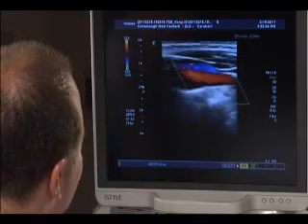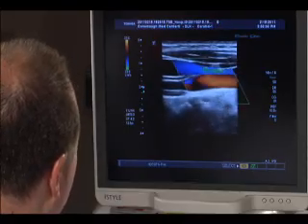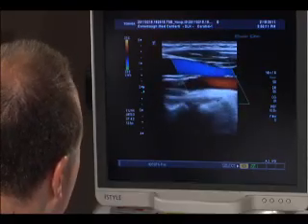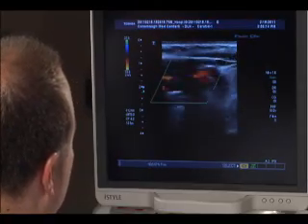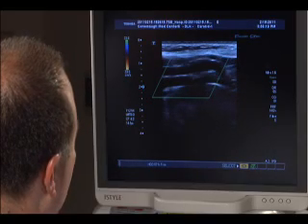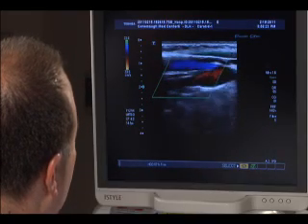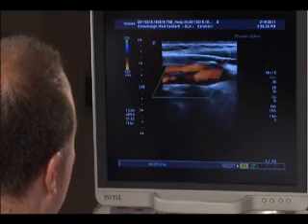And when you do one of these, does this get sent away then for some, like, do you talk to the patient right there, or the vascular surgeon does the official reading. Technologists take the pictures. Technologists are trained to identify critical findings and relay those findings to attending physicians and vascular surgeons.